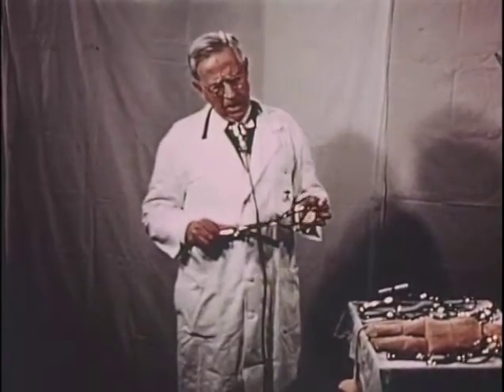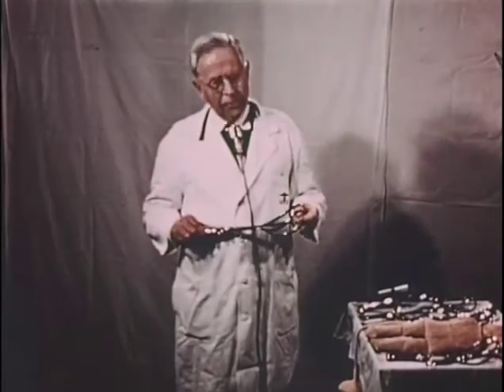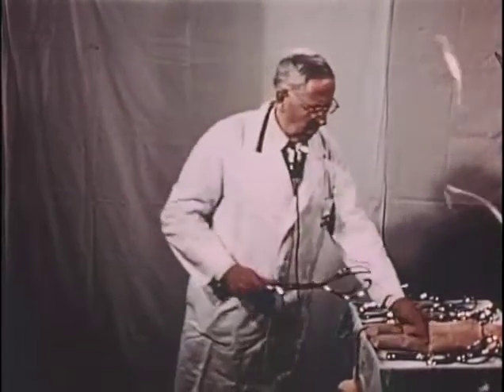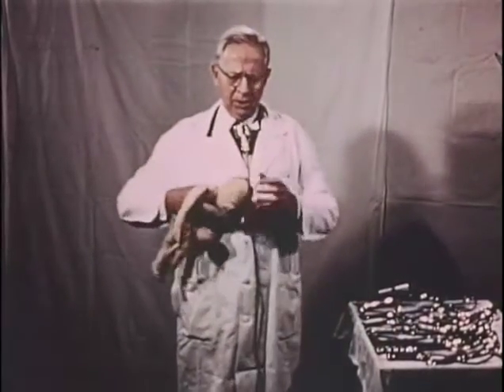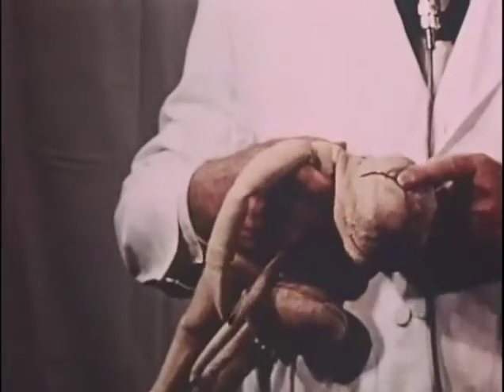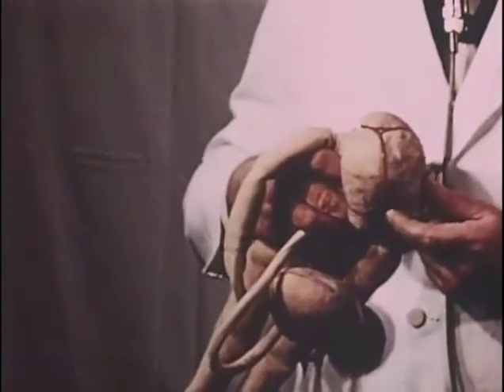It's not easy to determine an accurate application. However, one can be guided by three landmarks, two on the fetal head and one in the forceps. These are the posterior fontanelle, the sagittal suture, and the lower angle of the fenestration.